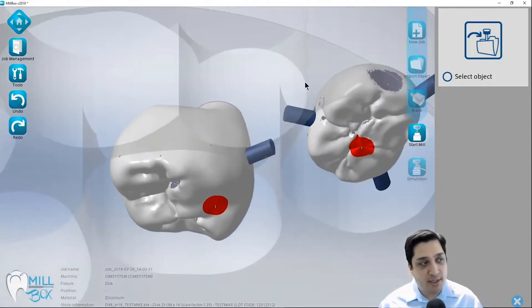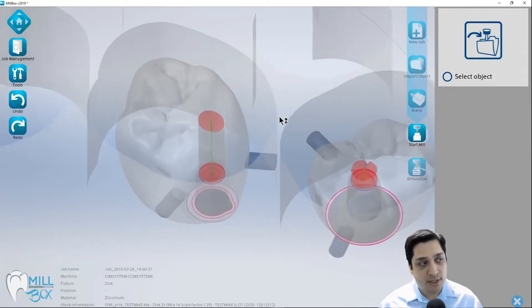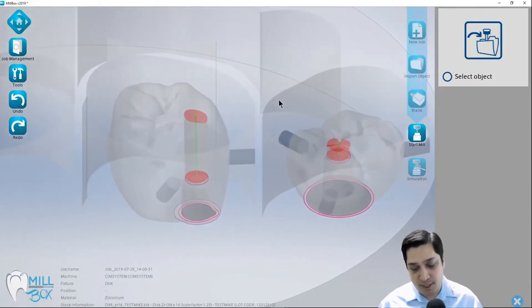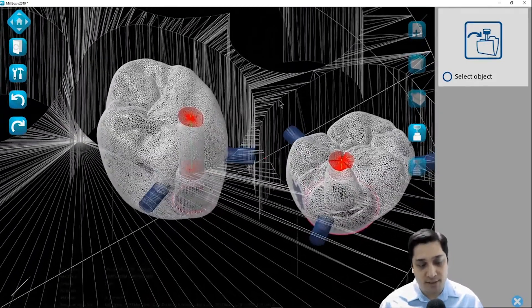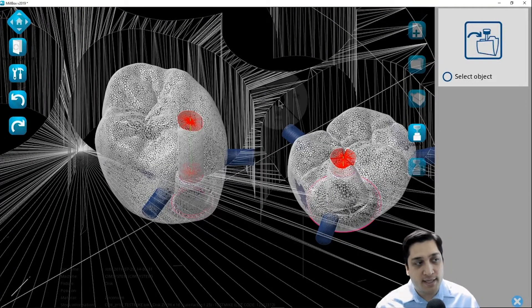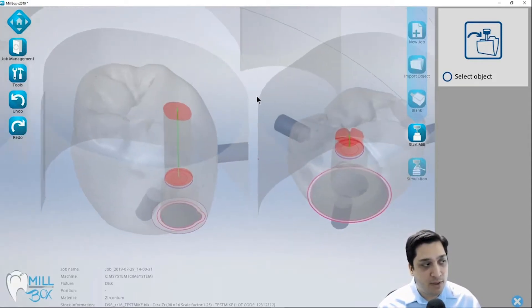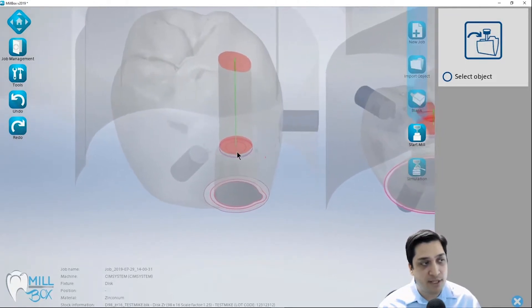The very first thing I typically do when looking at these cases is turn transparency on. This is the number 9 key on your keyboard. When you tap that once it's going to show you the parts transparent so you can see through them. If you hit the number 9 key again it's going to show you the mesh of those files. If you want to get back to normal, hit the number 0 key and that will get rid of that additional rendering mode.